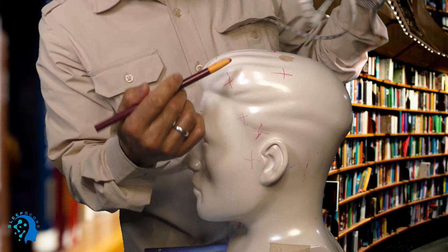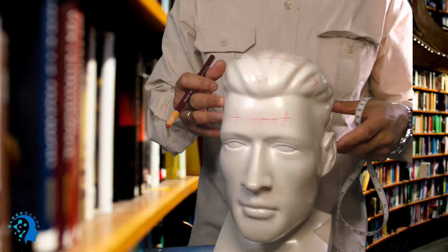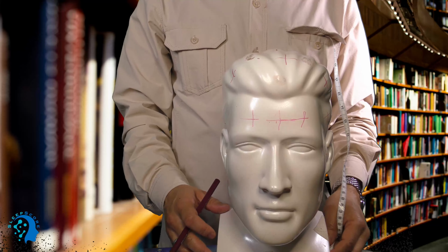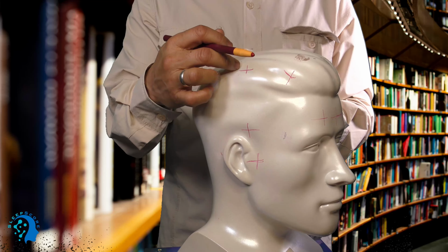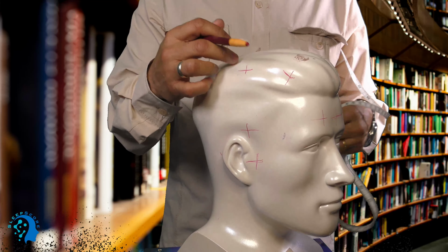So in that way you cross this line. For the exact measurement, make sure all of your lines cross. The cross indicates that you are measuring twice, which means you have to cut this point and find the exact point. If you measure from here to here, then the center of these two, then here to here, you'll get your F8. So you have to make a half of F8.